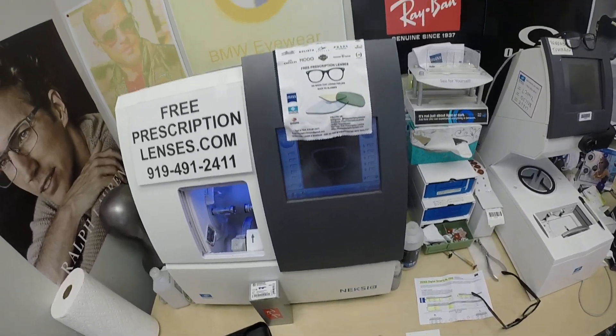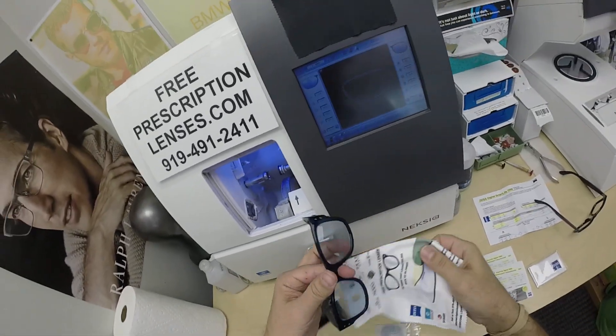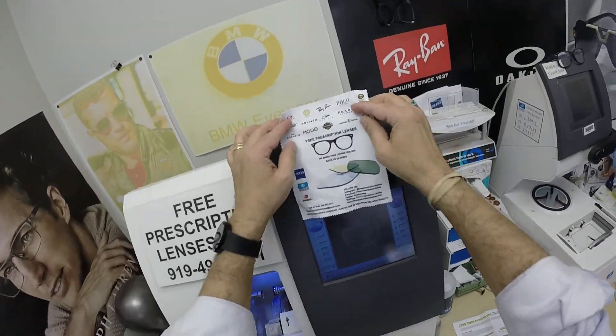Let me clean everything off. By the way, I field test everyone's cleaning cloth before I ship. So Angel, when you get this, you see the wrinkles in there — you know it works because I just used it.